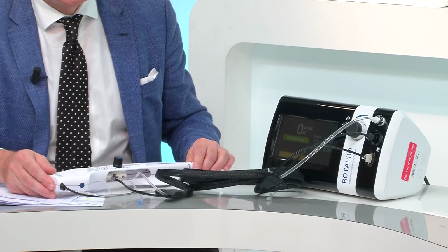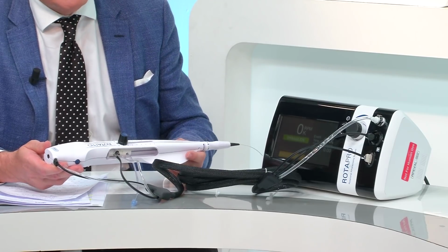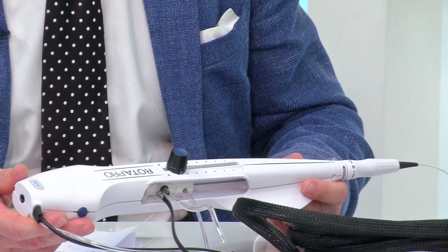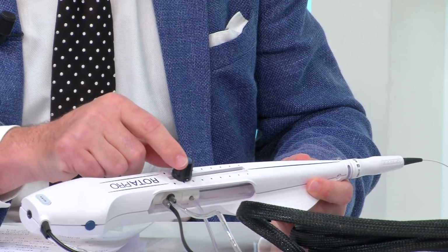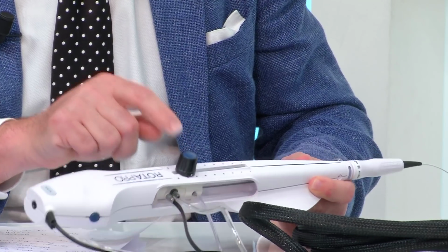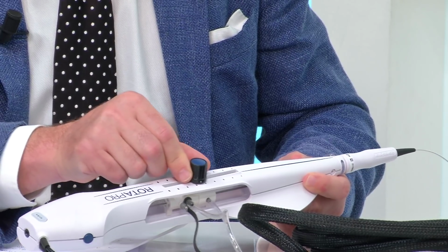Third component, yes, it's here, it's the advancer. And you can see that on this advancer there are 3 main modifications with 3 new buttons. So no foot pedal? No, that's the new one. There is no more foot pedal, so you don't need to coordinate perfectly the feet with your hand. The first button is on the top of the knob, just to activate the burr. So you push on it, and you will then do your pecking motion with your burr.